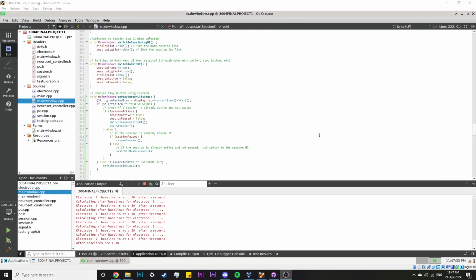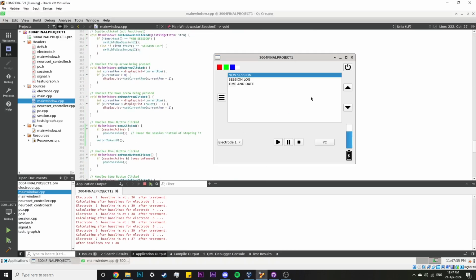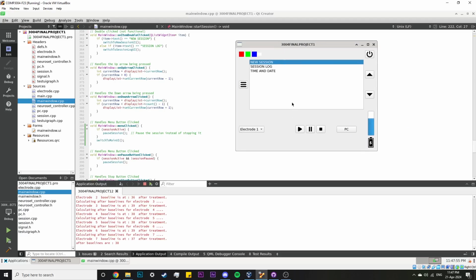So for battery depletion, as we can see, the session has completed successfully, and after each session, the battery depletes a certain percentage based on the number of sessions run, and once it reaches a total of 3 sessions, it would deplete to the bottom. So this is pretty much divided by 3, as stated in the spec, for it to deplete after 2 to 3 sessions.